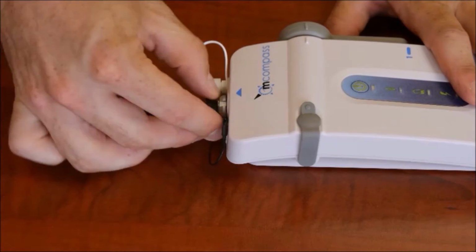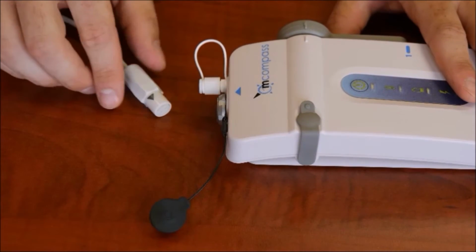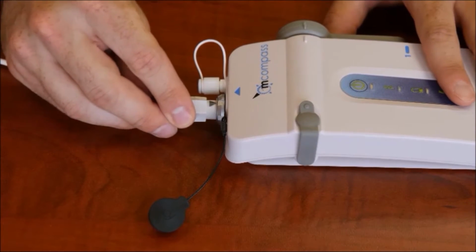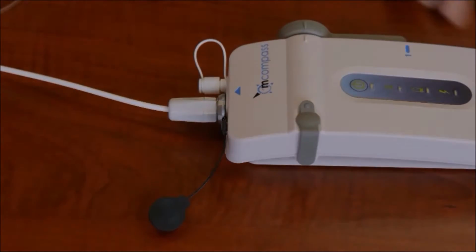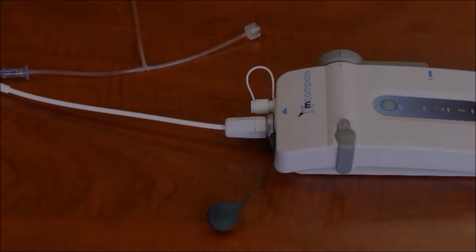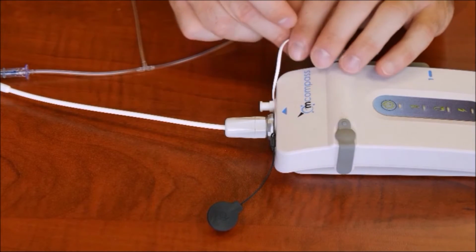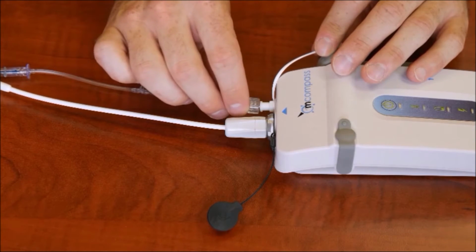To connect the fob and catheter, place the sphincter balloon connector into the larger opening on the fob. To ensure a correct connection, match triangle peaks from the catheter and the fob. Now connect the extension tubing to the white connecting port of the fob. The connection should be made by rotating the extension tubing until it feels tight.